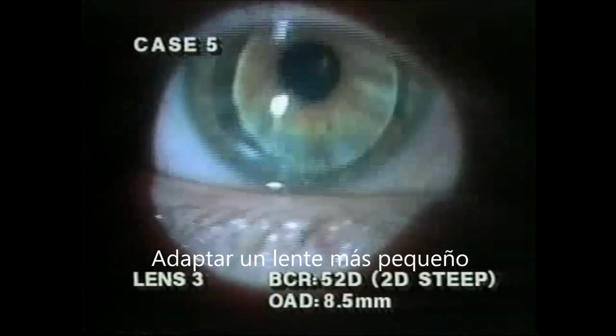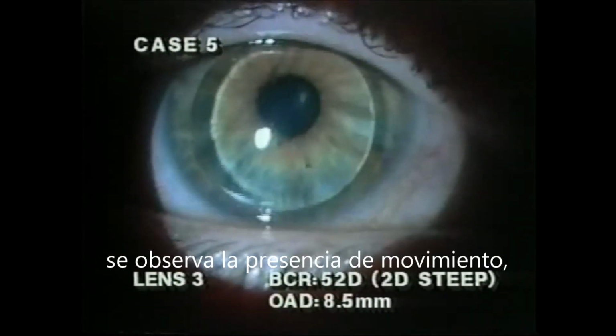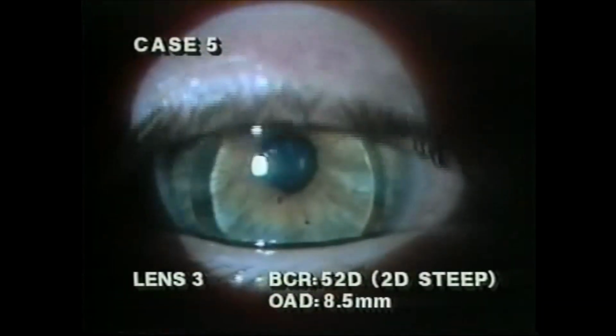Fitting a smaller diameter lens with a smaller optical zone appears to provide a better fitting relationship than the larger diameter lenses. There is an absence of both excessive edge lift and bubble formation. The lens still positions slightly inferior, however, and when partial blinking occurs, lens lag is insufficient.